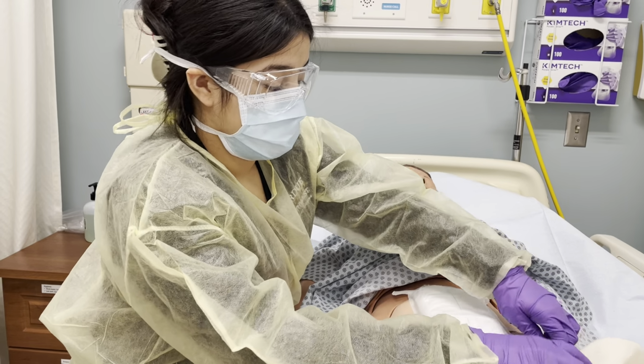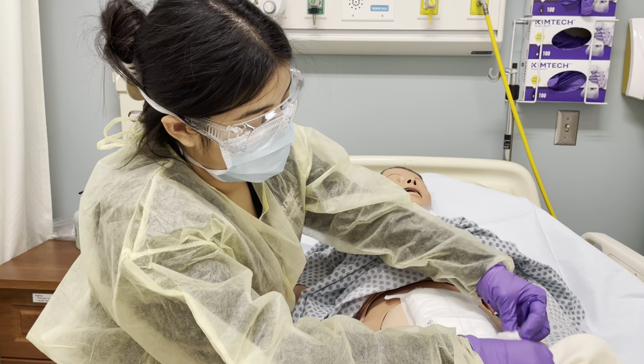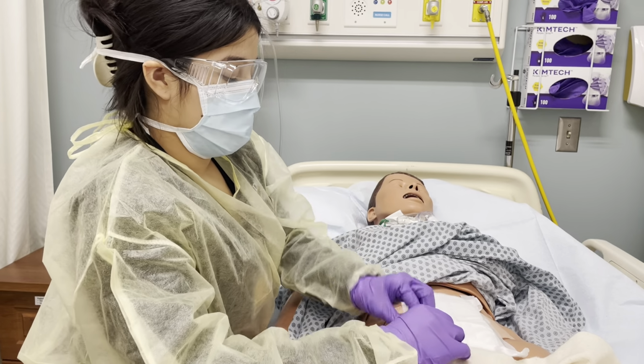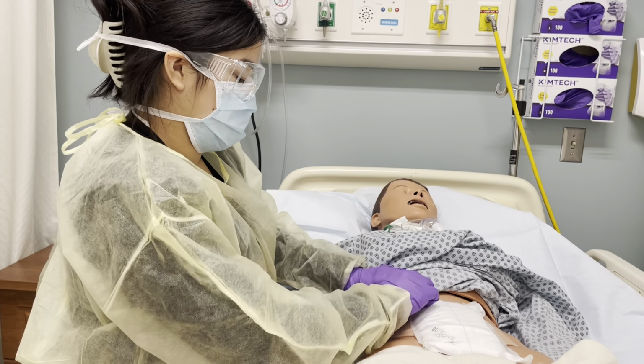diagnoses. Okay, start with this corner now. And now this corner. And I'm just going to keep push-pulling to remove my old dressing.